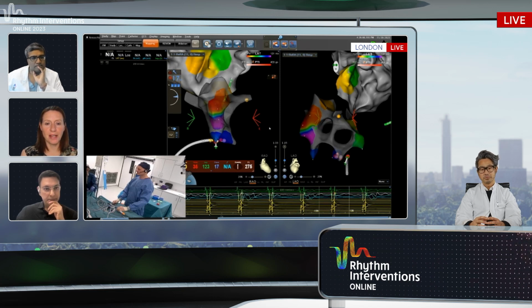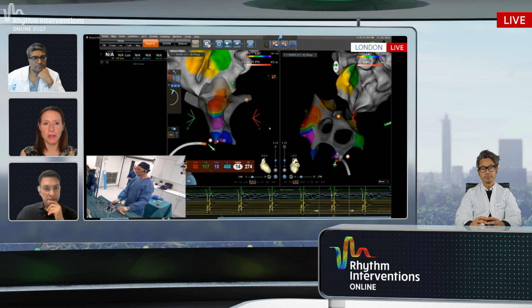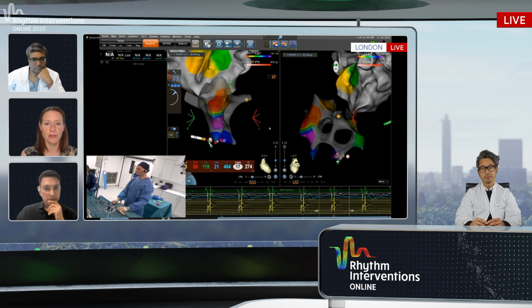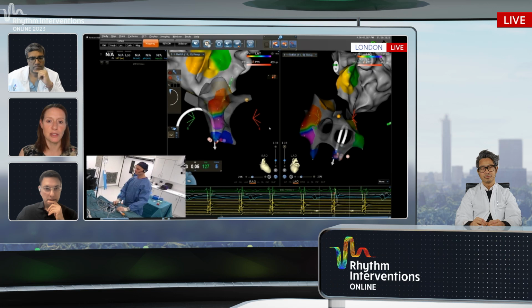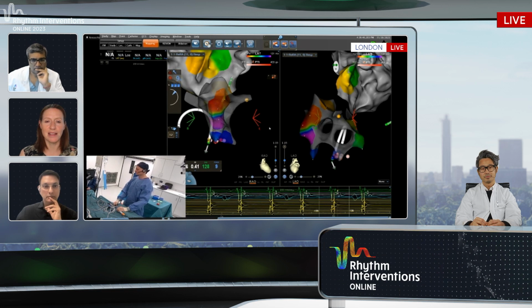Yeah, I agree with you. Actually, I've published on a series of congenital heart disease patients who were exactly in that category. A lot of them had macro-reentrant flutters, but quite a large percentage had micro-reentrant flutters, and we showed that very high density mapping helped in determining the best place to ablate, which wasn't always in the conventional place, but was in the area where you could get the most out of the fewest lesions. So you could create your line across the narrowest isthmus, which wasn't necessarily in the traditional place. So I think that high density mapping is very important in that respect.